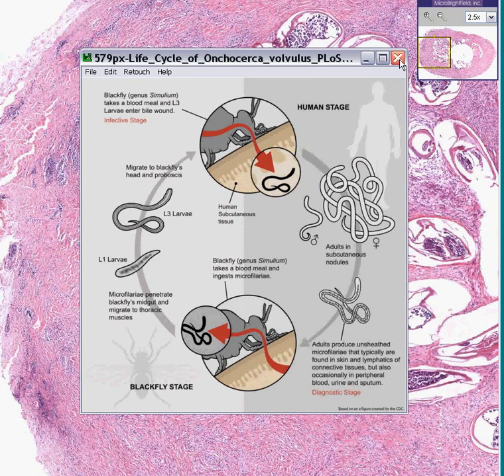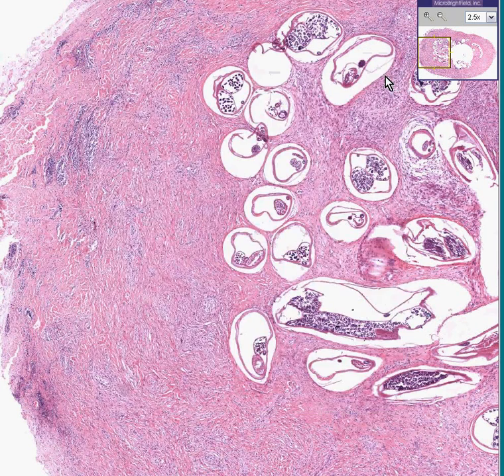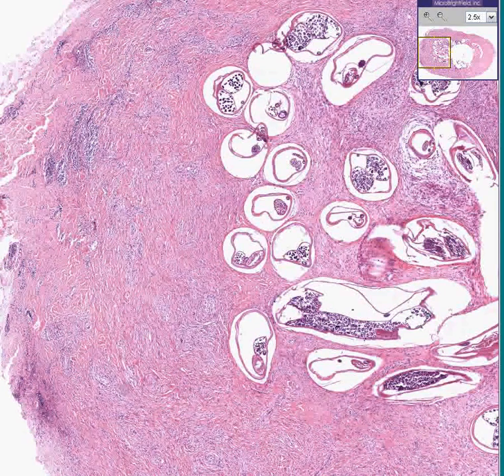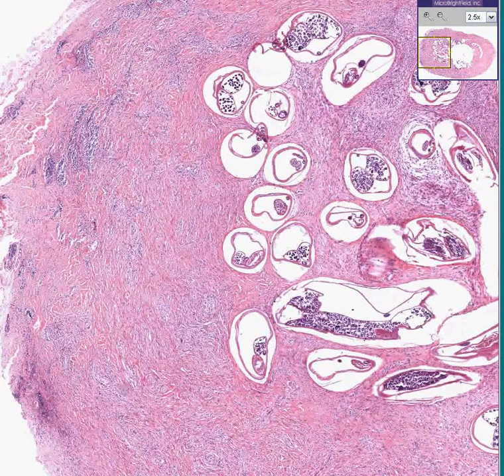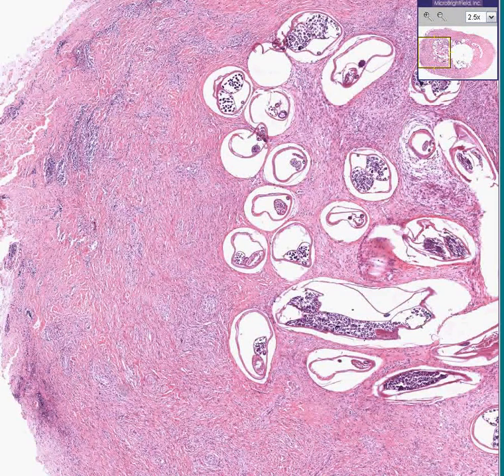This is Onchocerca volvulus — river blindness, second leading cause of infectious blindness in the world, chiefly in Africa.